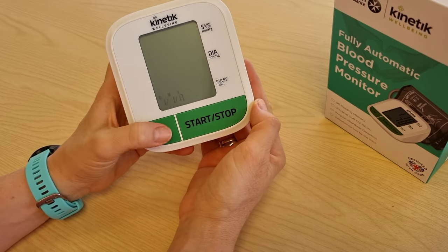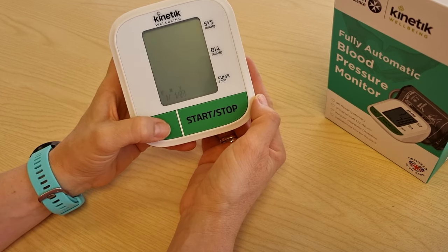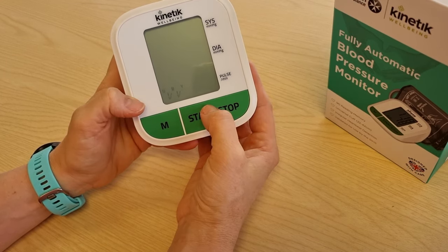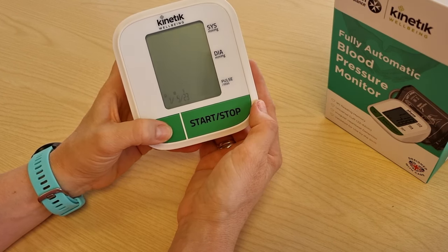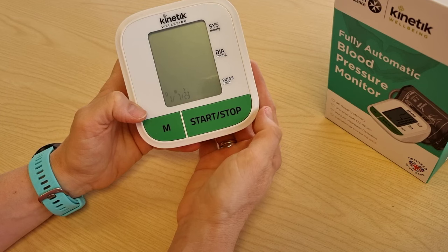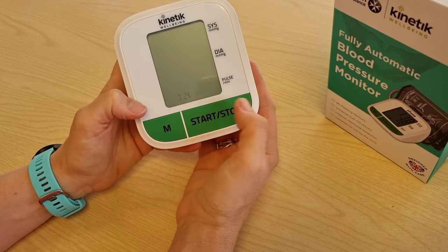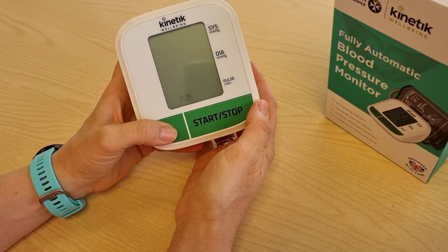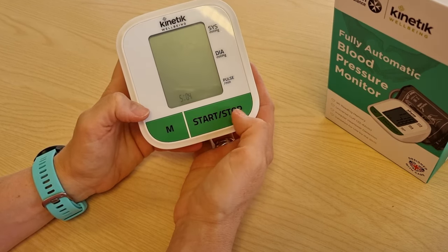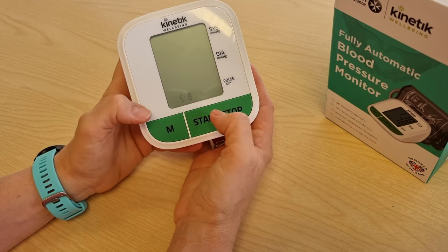You first have the year — use this button to toggle and start to select. Move over to the month and start to select, then the day and select. This will be your hour and this will be your minutes.